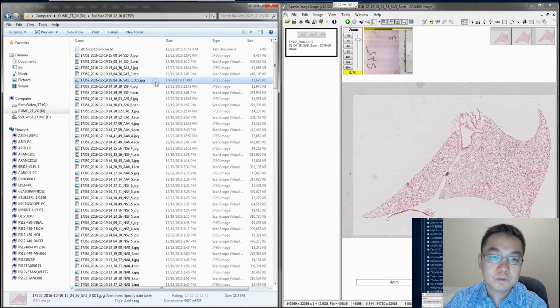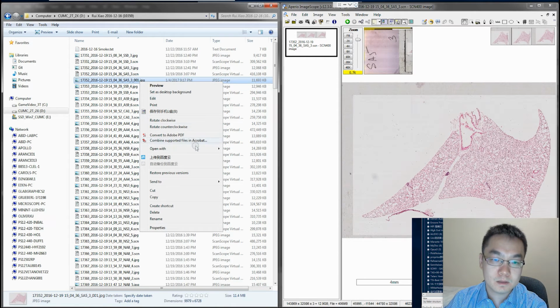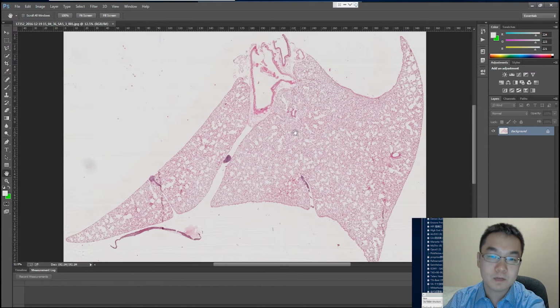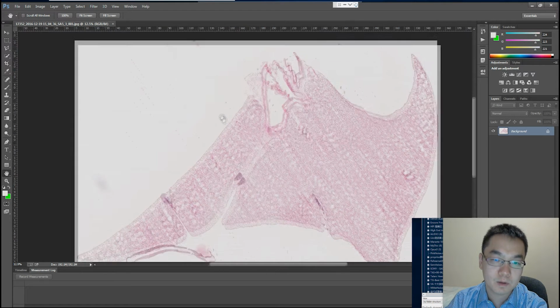Okay, now after you collected 10x equivalent images that represent your slide, you can open this file up in Adobe Photoshop. Here you can edit this file before you feed it into the Parenchymal Airspace profiling software. Generally, I do two types of things. First, clean irrelevant stuff out of the image, and also paint the non-parenchymal area with a particular color. So later in the software, it will automatically recognize the color and count them towards non-parenchymal area.